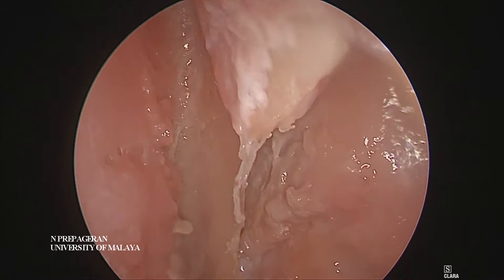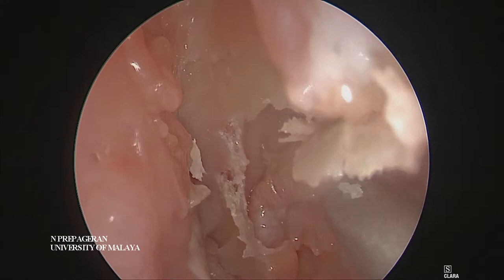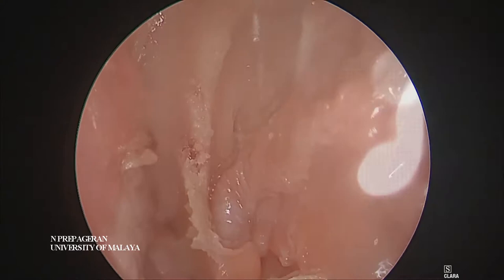Once you've seen the olfactory neuron on both sides, what you want to do is remove this part of the septal cartilage or the septal bone here until what you're looking at is the frontal beak. So now you're looking at the frontal beak itself. Anatomically, I know we're looking at the frontal beak and all we need to do is drill here and we are in the frontal sinus.